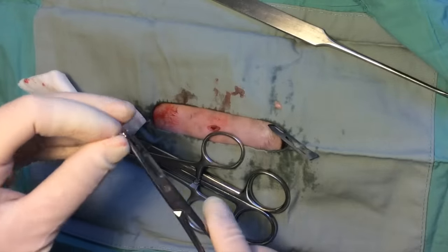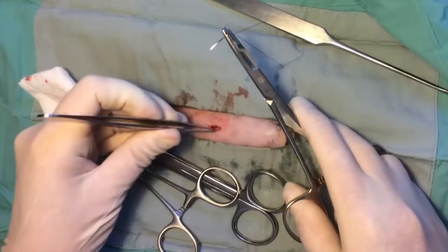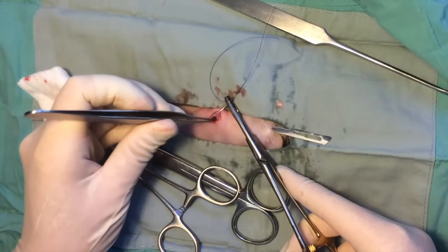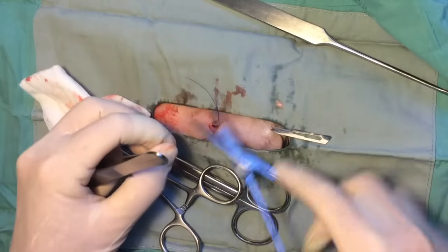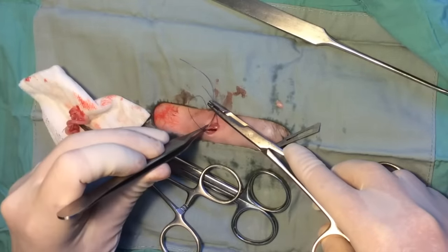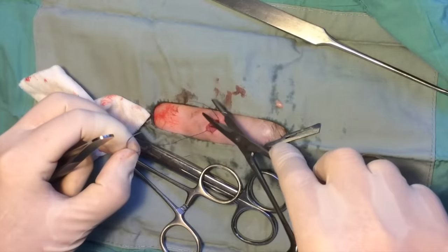The abdomen is closed routinely using 4-0 monofilament absorbable suture with a single cruciate suture. The first surgeon's throw is placed only tied enough to appose tissues without slipping and the square knot is tied with a minimum of five throws. Adequate bites of external rectus sheath are taken to ensure suture security, and care is taken not to crush the body wall during suturing and knot tying.